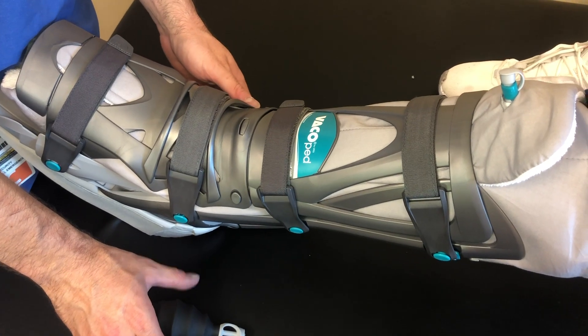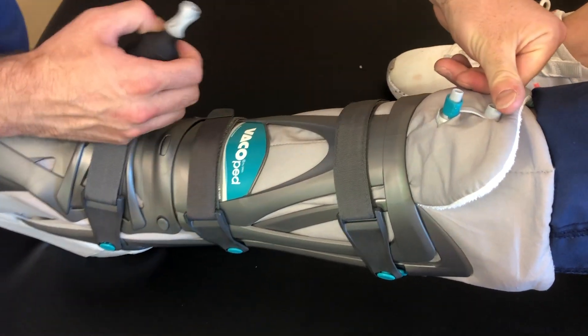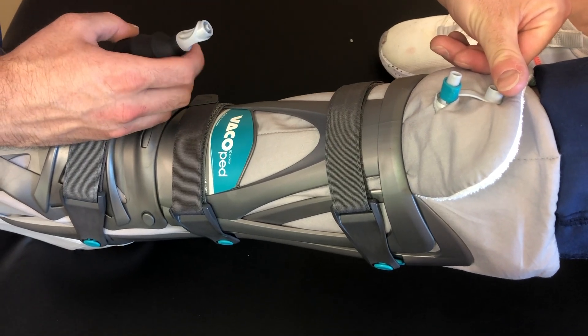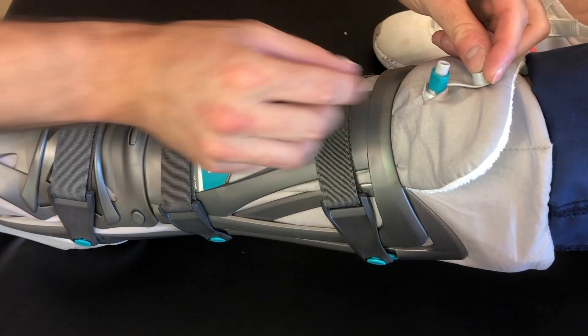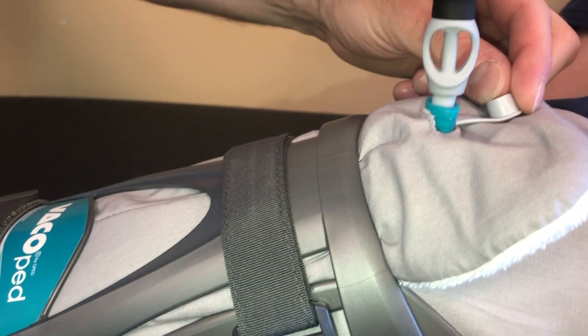Next, to utilize the vacuum feature of the boot, first locate the valve at the top front portion of the liner. Open the cap on the valve, ensuring the turquoise valve ring is pushed down. Attach the hose portion of the pump to the valve.